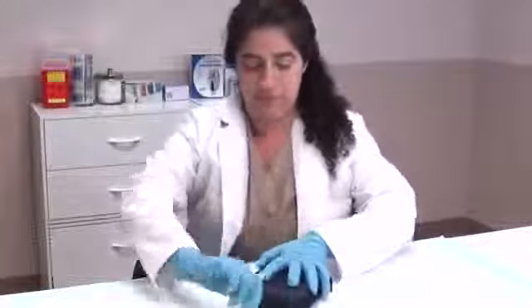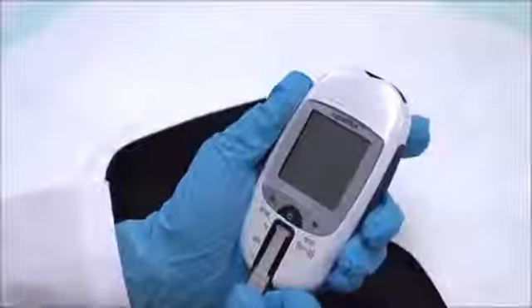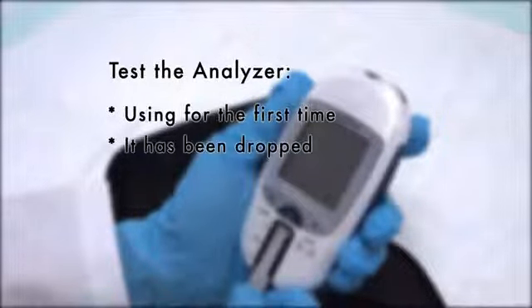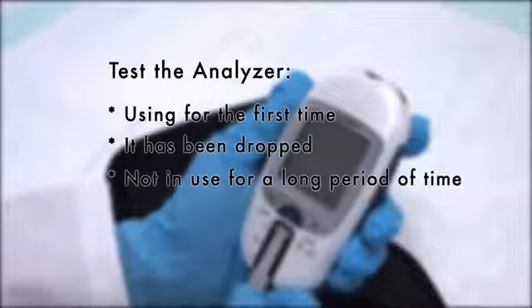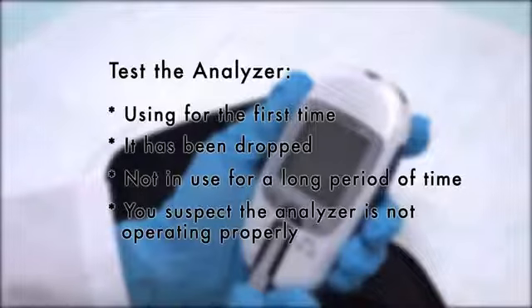Quality control. Photosensor test. The photosensor should be tested with the check strip to determine if the lipid testing module is working normally. It should be tested before using the analyzer for the first time, if you have dropped the analyzer, if you have not used the analyzer for a long time, or if you suspect the analyzer is not operating properly. Testing should be done out of direct sunlight.